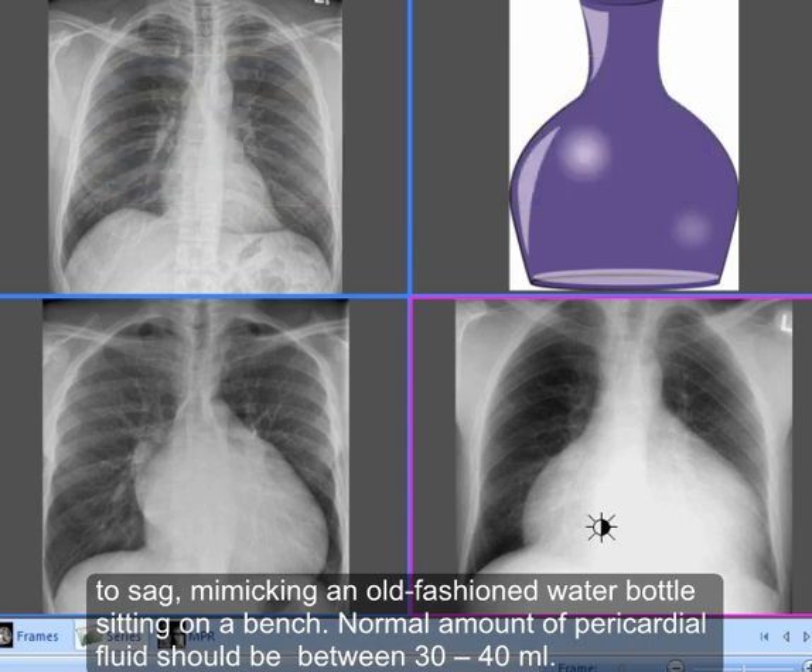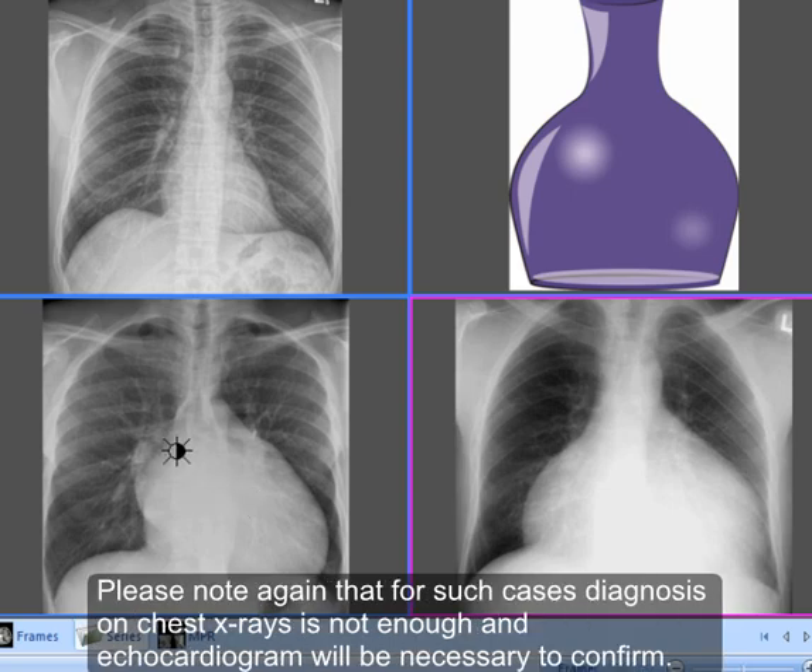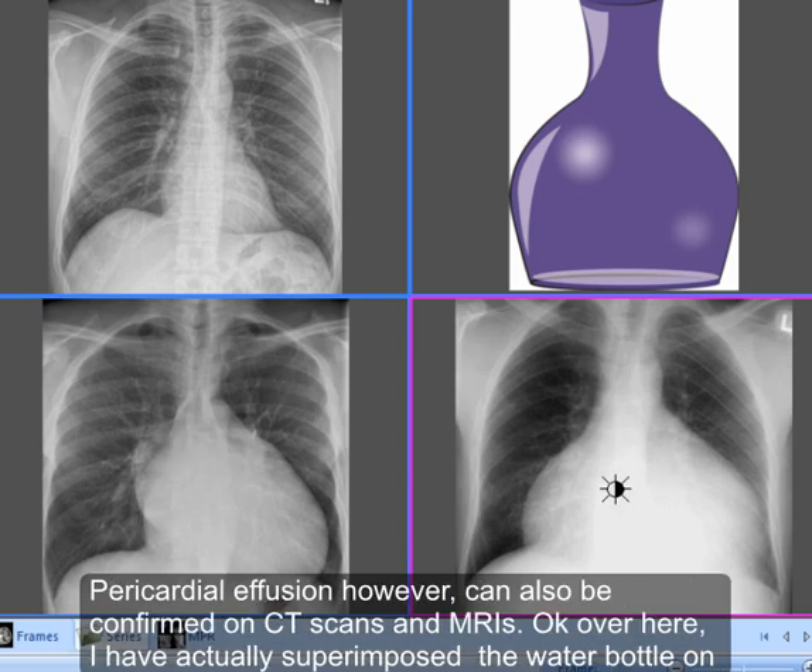Normal amount of pericardial fluid should be between 30 to 40 ml. The X-ray in the left bottom corner actually has mitral valve disease causing enlargement of the left ventricle and thus causing cardiomegaly. Please note again that for such cases, diagnosis on chest X-rays is not enough — an echocardiogram will be necessary to confirm. Pericardial effusion, however, can also be confirmed on CT scans and MRIs.